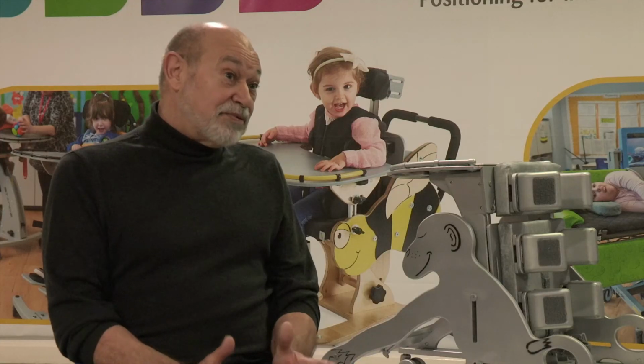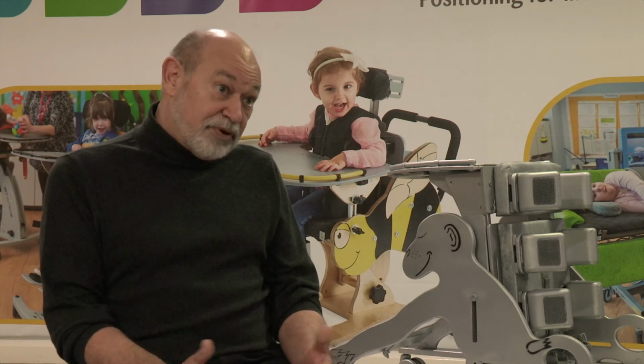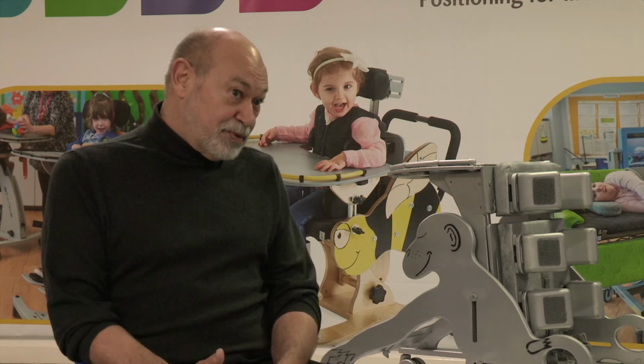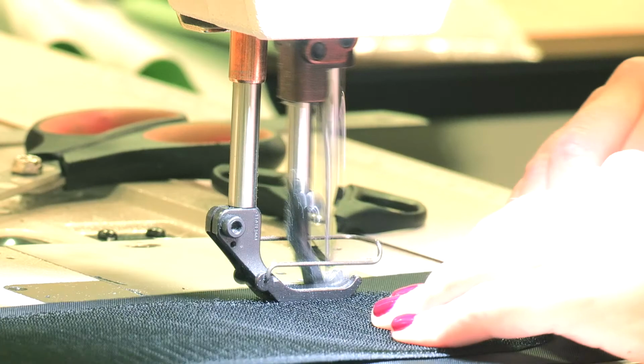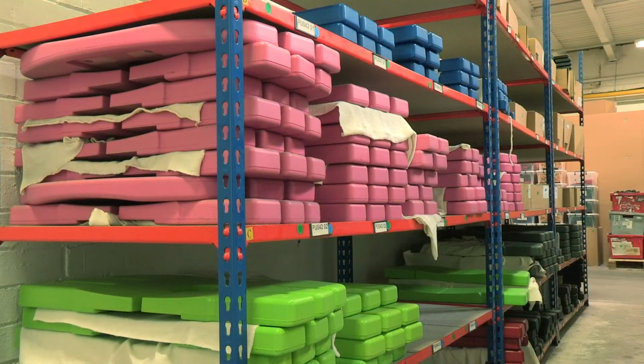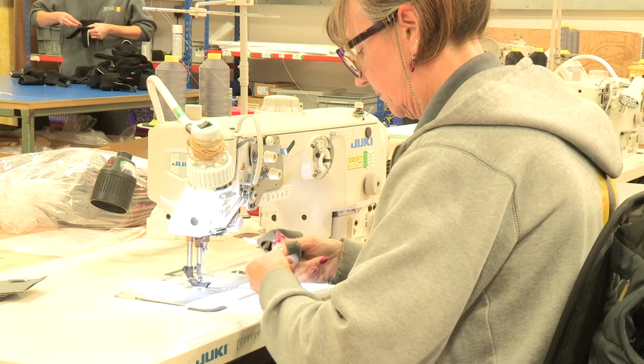Fundamentally, Monkey's the same product as it was 25 years ago. A number of improvements have been made. Putting it on casters was an early one, but also the introduction of a gas spring, different upholstery, plastic trays and so on. All improve the function and look of the product to a large extent.